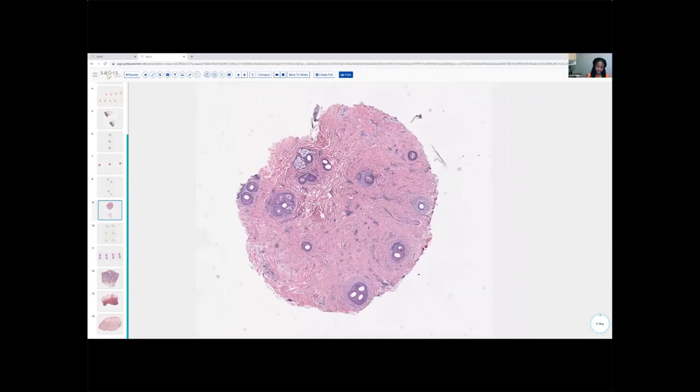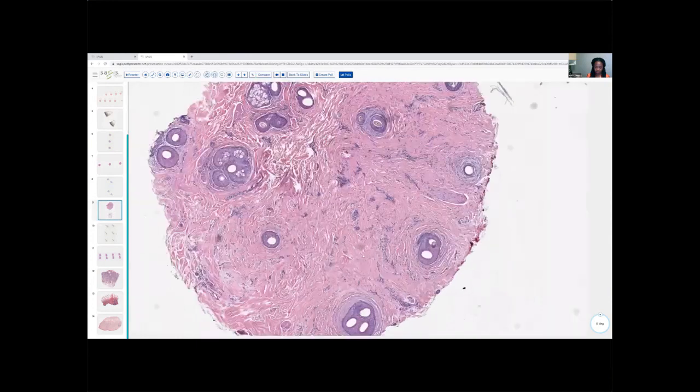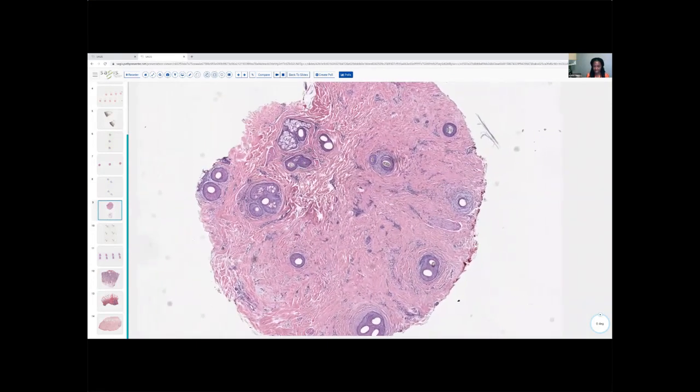And we clearly see that there is profound hair loss here. We see areas where we would expect to have hairs and we just don't have them. And what's also notable in this example is that we don't just have those loose connective tissue collections, we have actual dense scar here, right? This really kind of concentric fibrosis of a good scar. And then looking at the anatomy of the hair follicles, there's this polytrichia. So that's just, again, another feature of scarring. So we figured out that this is a scarring alopecia, but which one?